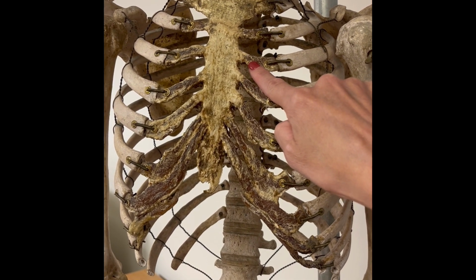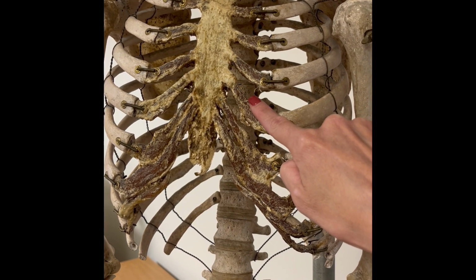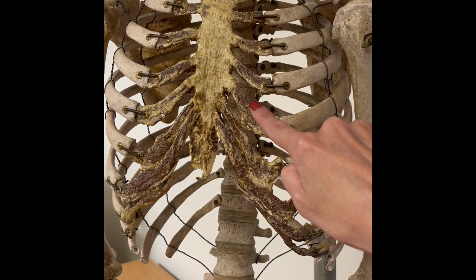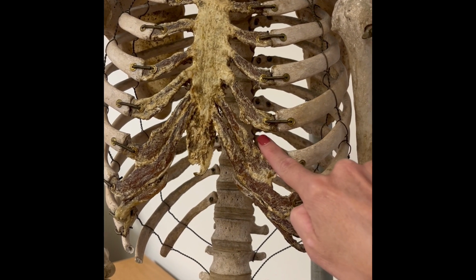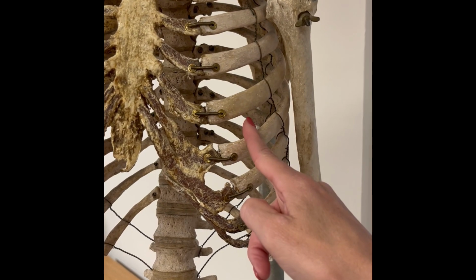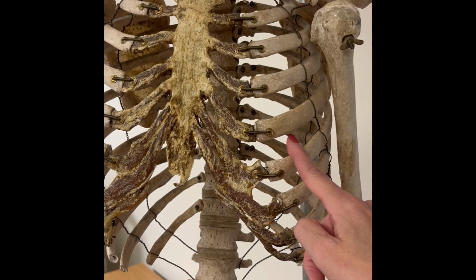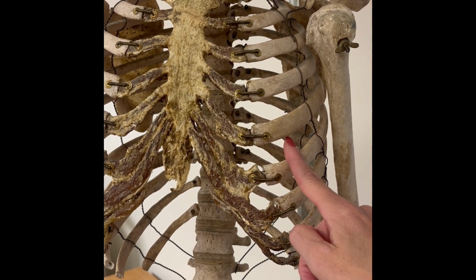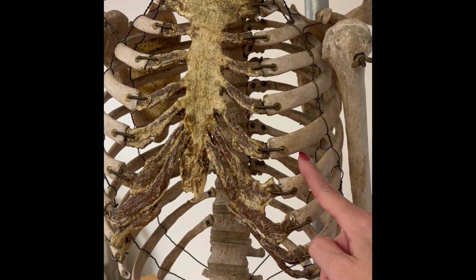Then we're going to move down into the fourth intercostal space, starting to move just slightly away from the sternum, and we're going to listen for the tricuspid valve. And then we're going to move into the fifth intercostal space over at the midclavicular line, and we're going to place our stethoscope here to listen to the mitral valve, which is also the point of maximum impulse on palpation, and it is also the apical pulse.